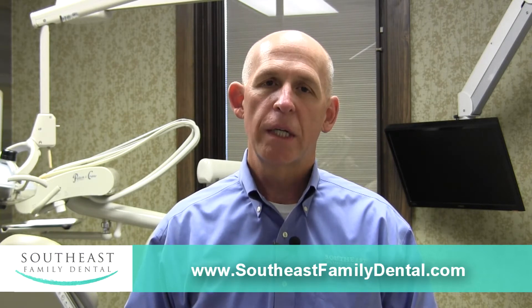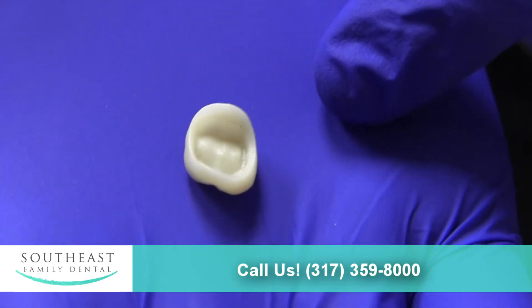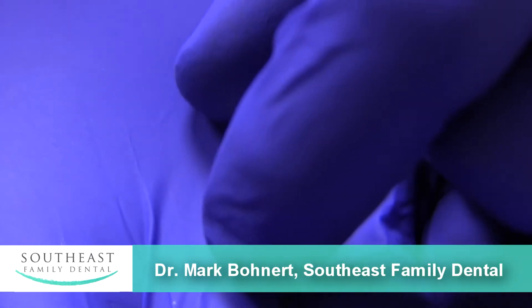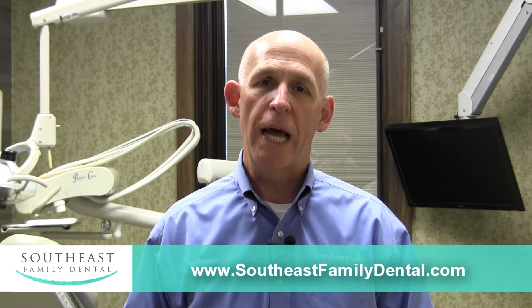In the old days we would use a lot of gold and porcelain fused metal crowns and bridges. Nowadays we have this newer material that is zirconium and it is extremely hard, very difficult to fracture. The only downside of this type of crown is it is not quite as cosmetic as some of the porcelains. It is far better than gold, however it does not have some of the natural translucency of a natural tooth.